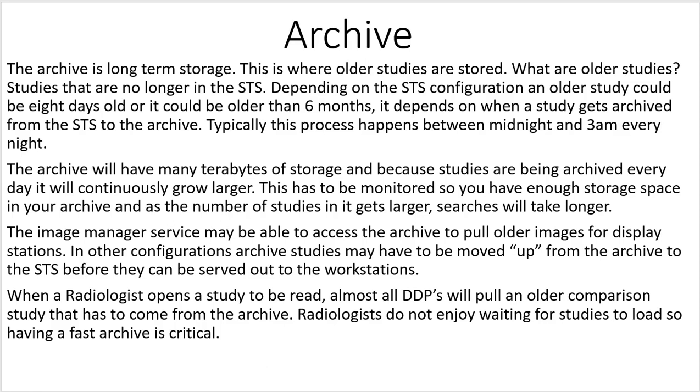The archive is long-term storage. This is where older studies are stored. What are older studies? Studies that are no longer in the short-term storage. Depending on the STS configuration, an older study could be 8 days old, or it could be older than 6 months. It depends on when a study gets archived from the STS to the archive. Typically, this process happens between midnight and 3 a.m.